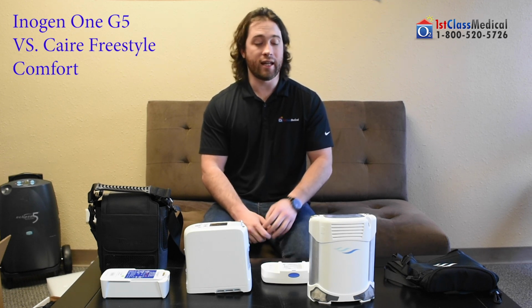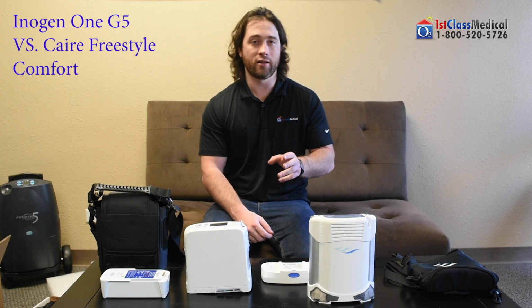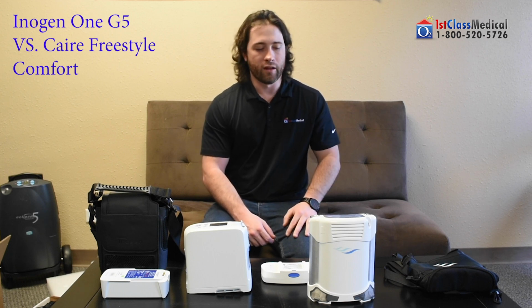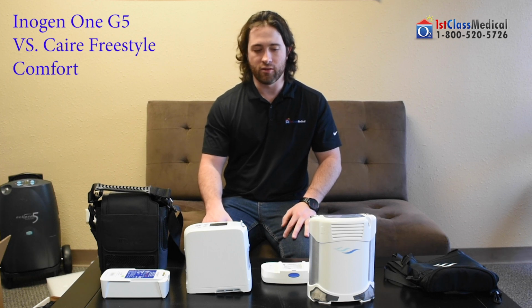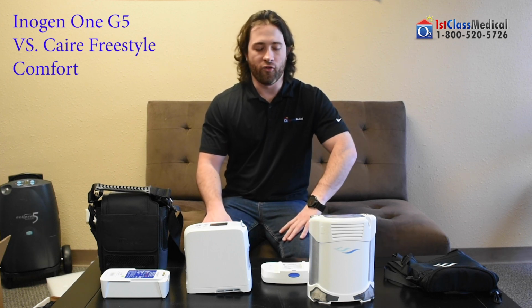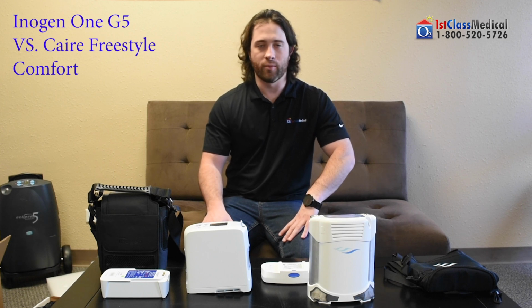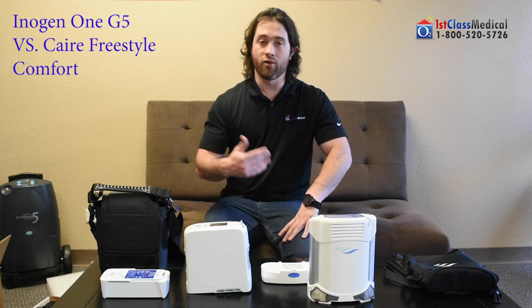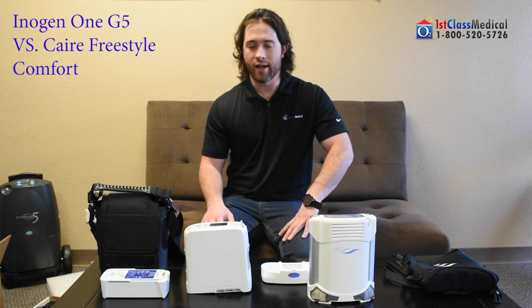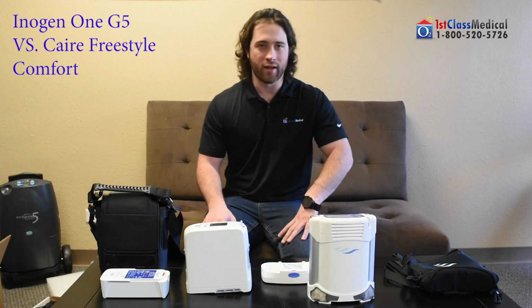And as I stated, they're going to make sure that they guide you to the best portable oxygen concentrator for your needs. They'll most likely talk to you about these two units as well if they find out that your needs are aiming this way. And hopefully after watching this video, you'll have a little bit more information and knowledge going into it, knowing, hey, this is the unit I want. But I can tell you right now, you choose one or the other, you will not be disappointed.